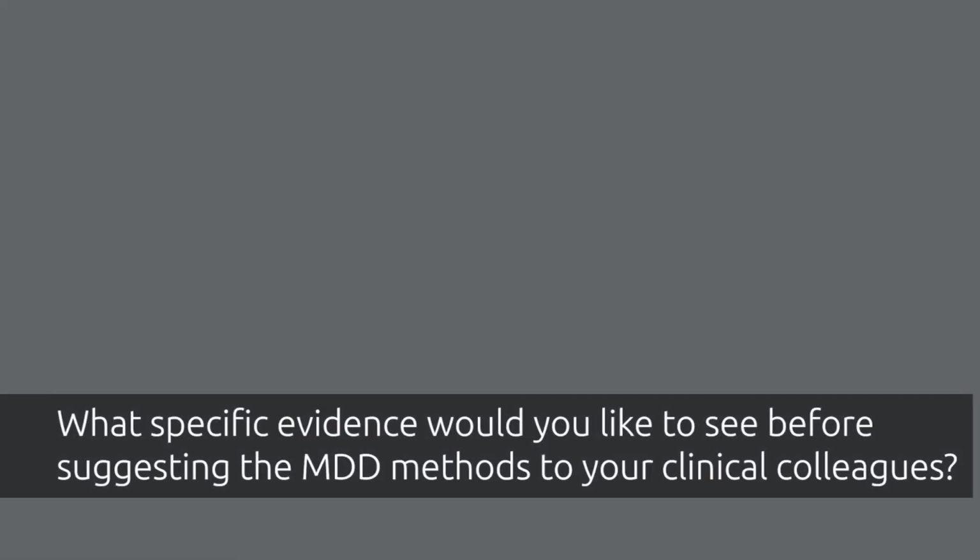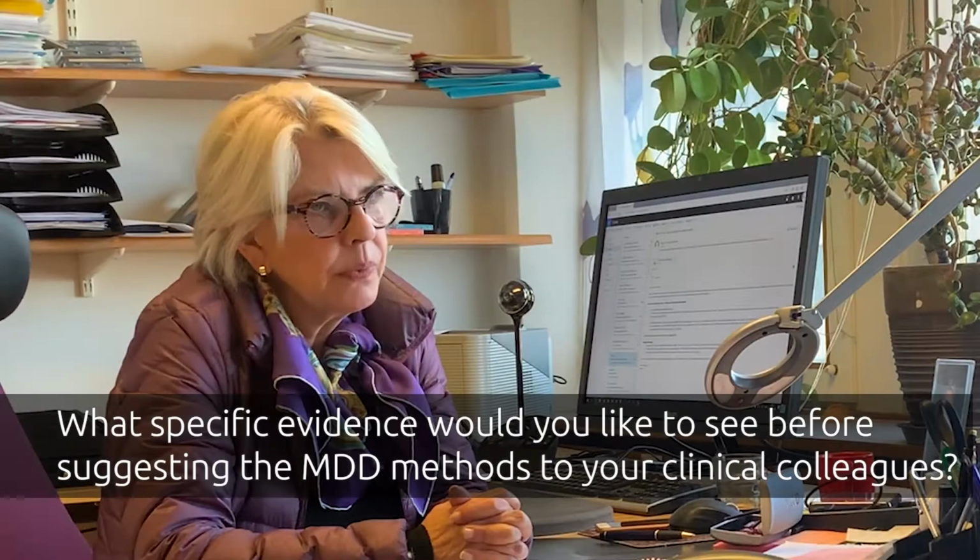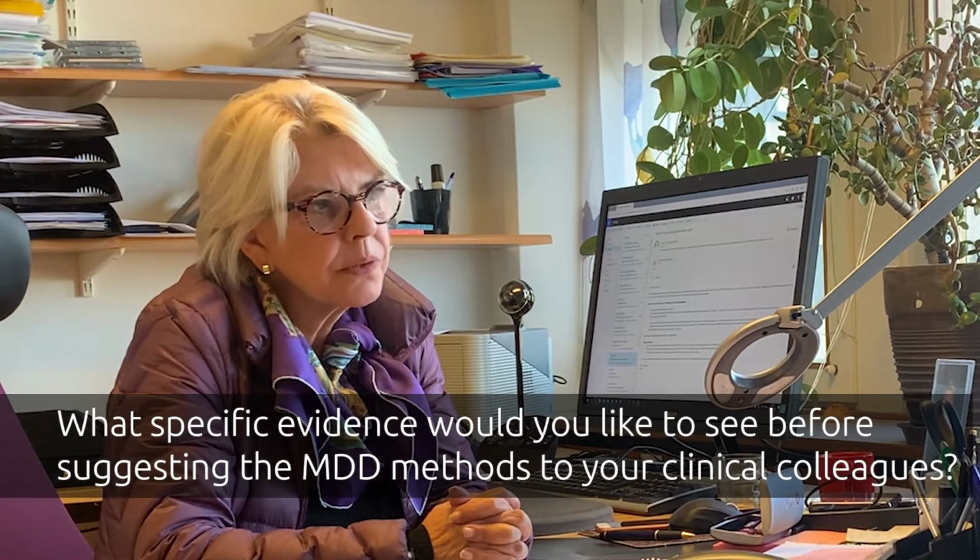If you were considering exchanging the standard protocols, what would be the specific evidence that you personally would like to see? Well, I would like to see that it actually holds in every patient, which means that it works every time, which we know the diffusion weighted images do if the patients lie still. So it would be nice to have a continuation to see that it holds.